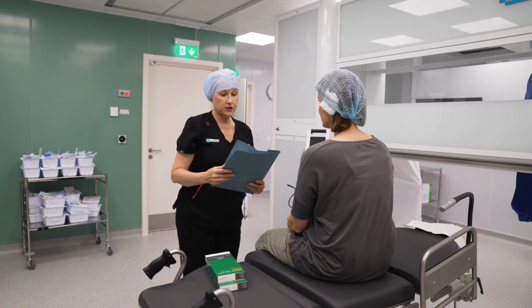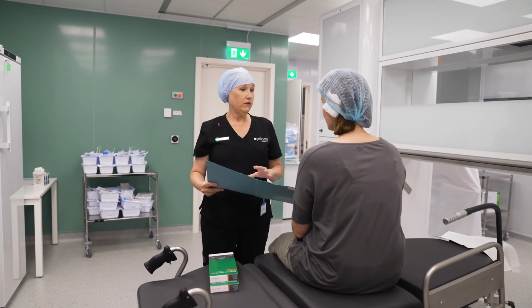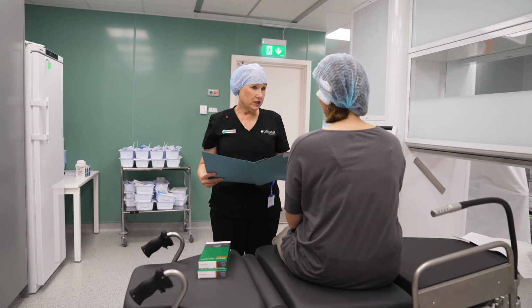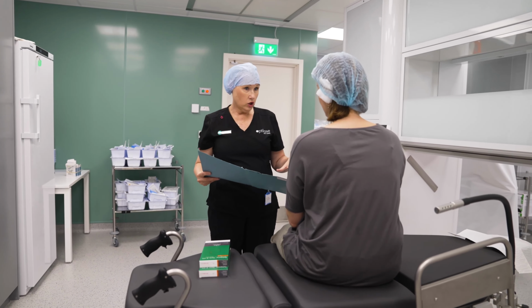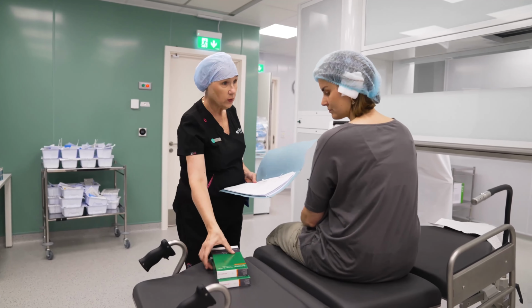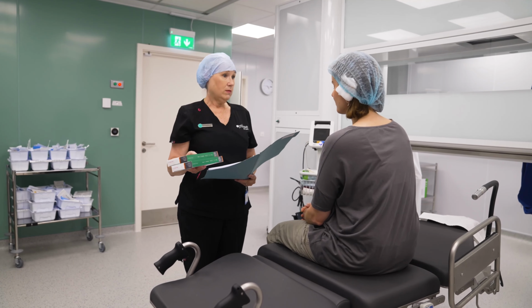We will put lots of numbing drops into your eye. So they're called topical anesthetic drops, and what they do is they numb the surface of your eye so that you will have no pain at all during your procedure. You are awake for your procedure, and this is important because then you're able to listen to any instructions that the surgeon wants you to follow, as in looking at a light, so that you're coherent, you can understand what he's asking you to say, but you will not feel any pain at all. And we also have extra anesthetic drops that we put in during the procedure so that you won't feel anything.